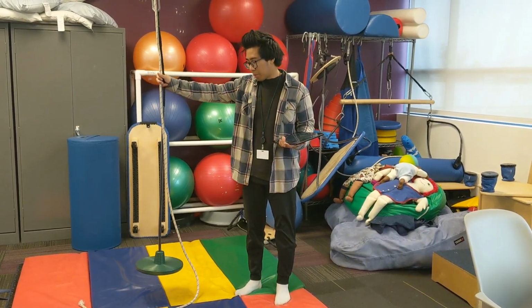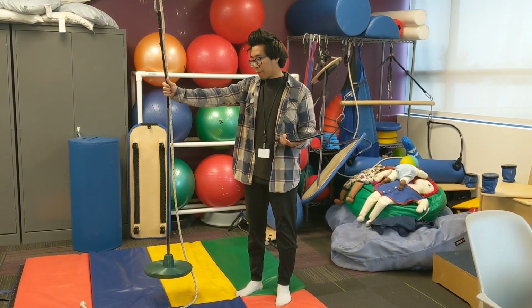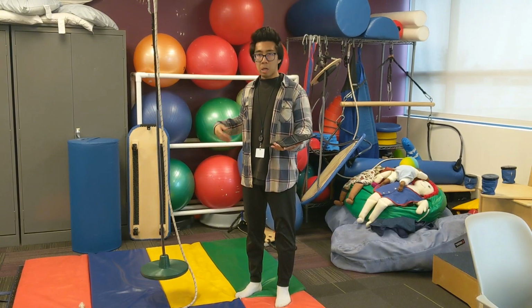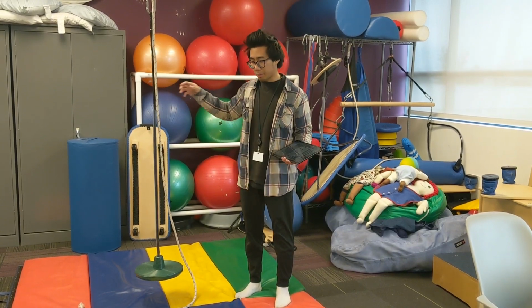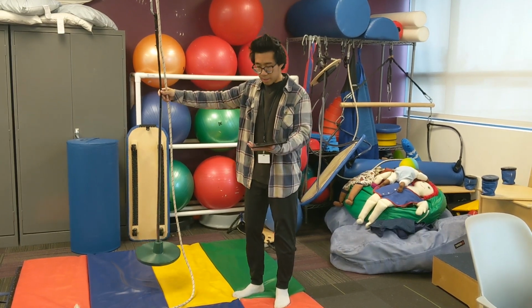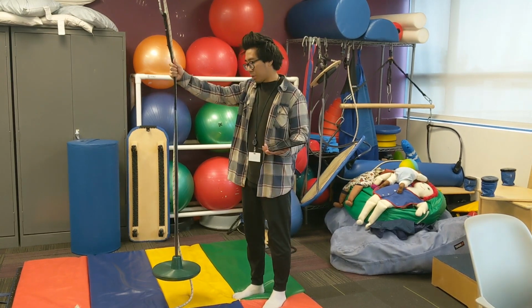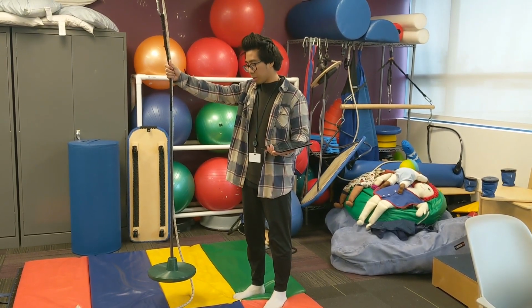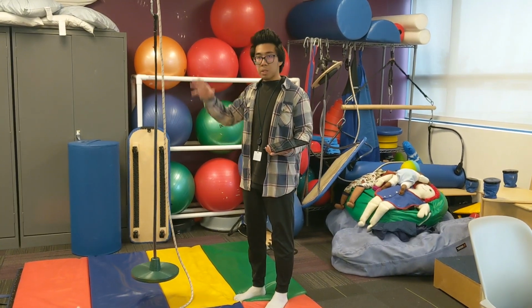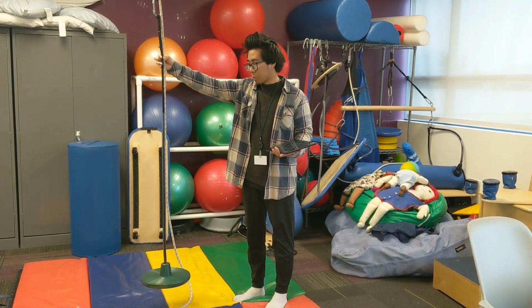As I mentioned previously, the main purpose of this is to provide vestibular input, proprioceptive input, tactile input, as well as motor planning. So we want the child to problem solve on what body parts to move, what certain movements they can achieve, how to get on and get off. But also at the same time with this disc swing, an emphasis here is working on your trunk, because you need to be able to use your trunk efficiently in order to use this swing, as well as your grip strength. Without your grip strength, you won't be able to use this swing effectively.